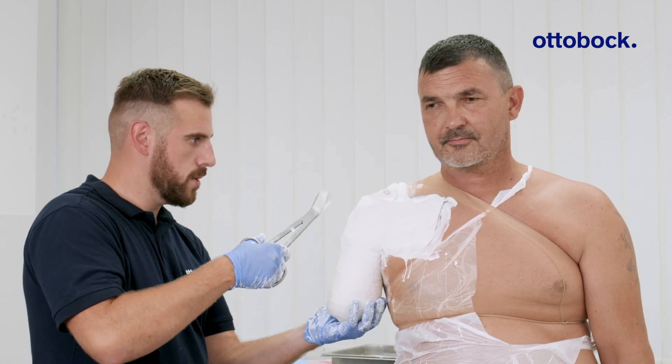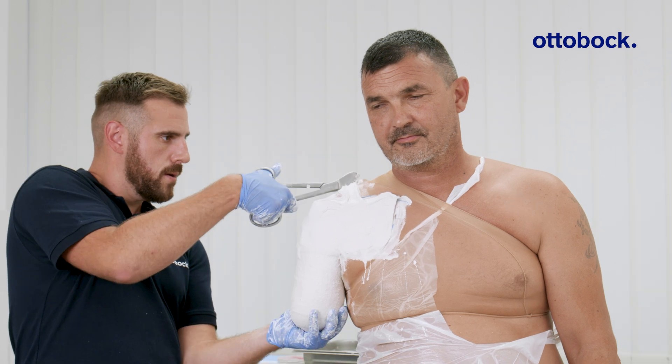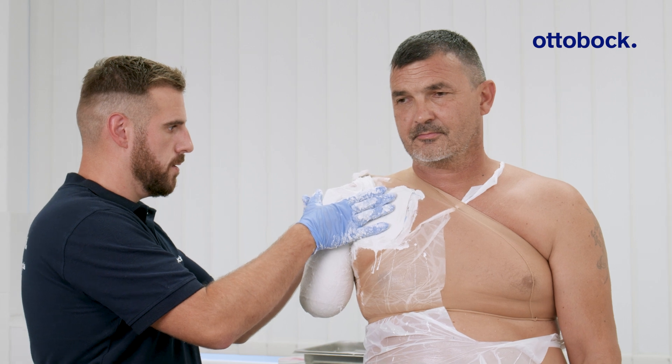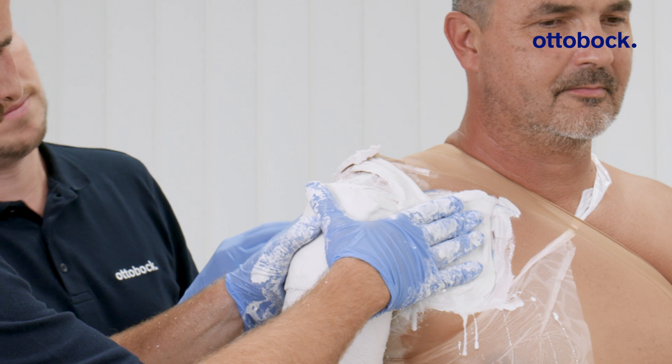Once the bandage material has fully hardened, open the joining piece. Apply firm pressure to the contact areas and mark the overlapping section.